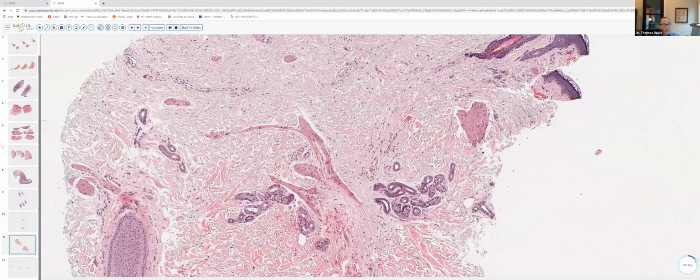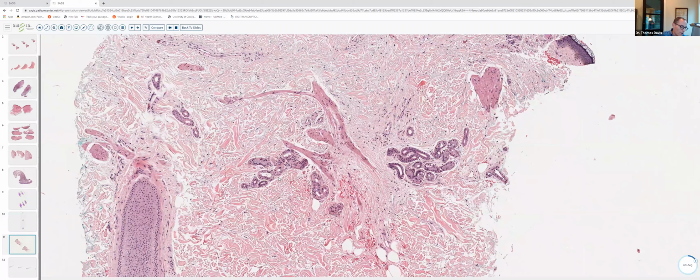So this is very characteristic, again, of Argyria. And of course, Argyria can result from dietary ingestion of silver, or medicinal or occasionally industrial exposure to silver-containing agents. And it produces, of course, this characteristic blue-gray slate pigmentation that can be photodistributed. You can also get localized Argyria if the silver is applied topically, or if it's traumatically implanted in the skin.